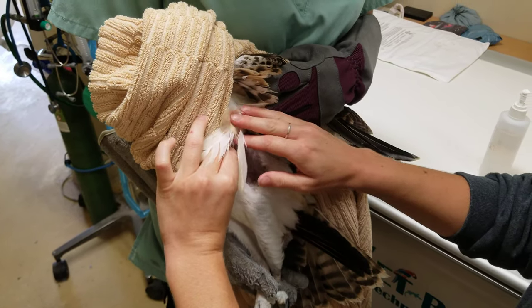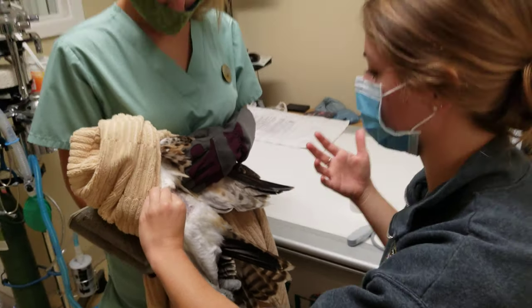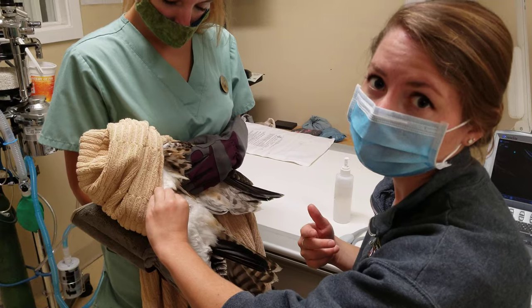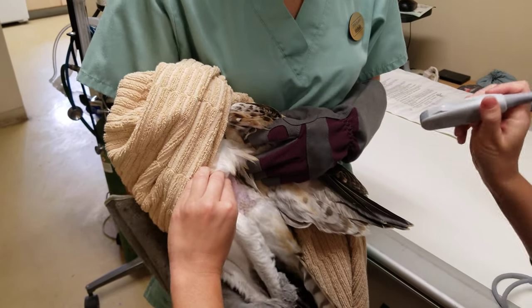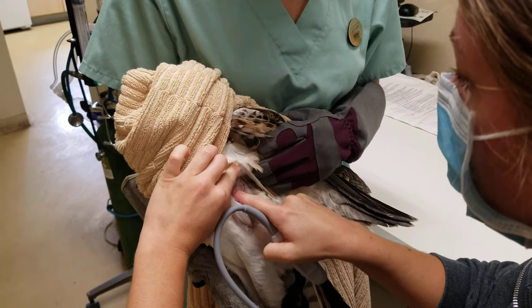For water birds, the gel may affect their waterproofing, so that's why we tend to use alcohol instead. It definitely still has an effect on feather quality, but not as much as a gel would on their waterproofing. So we're going to hold our probe horizontally with the marker facing cranially.